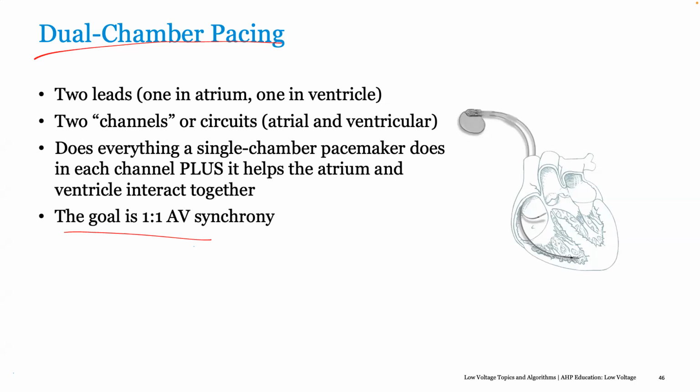Mr. Gerard, for a patient with biventricular heart failure that will require biventricular pacing, and has chronic permanent AF, do you support the issue of not pacing the atrium?